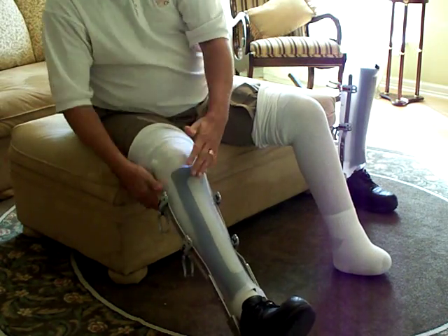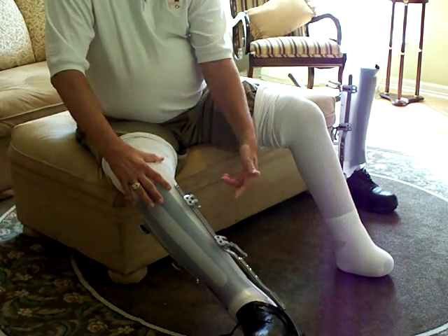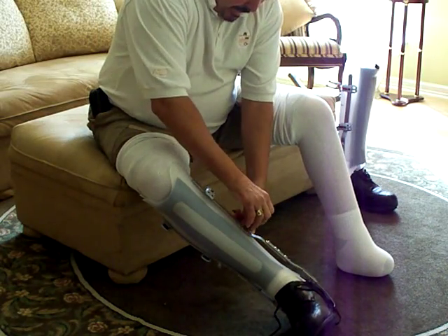Slide it in. Line up your little guidelines that I have here. Pull your foot out of the bottom of the shoe, and then you're pretty much ready to buckle it up. Pretty straightforward.